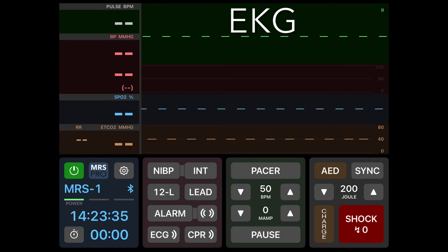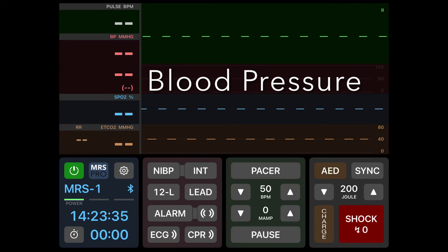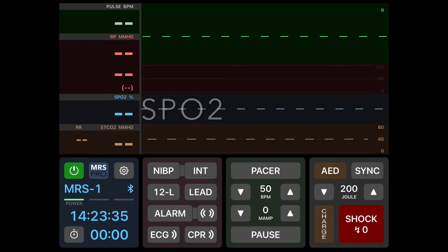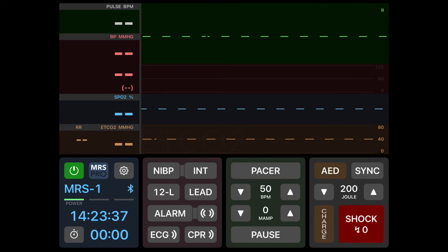From top to bottom the student can see EKG, blood pressure, SpO2, and end-tidal CO2.